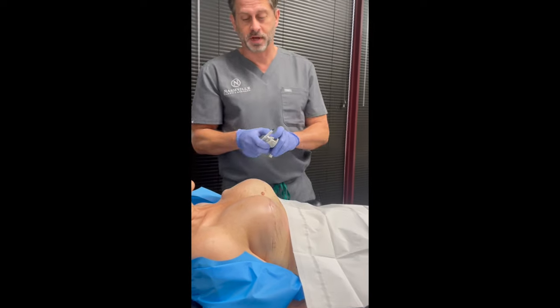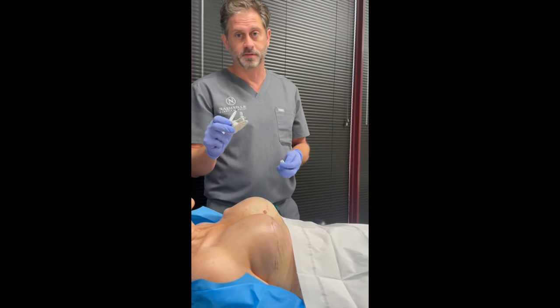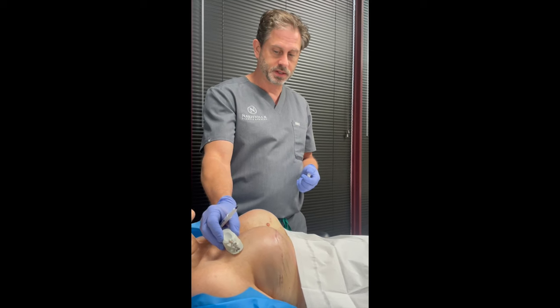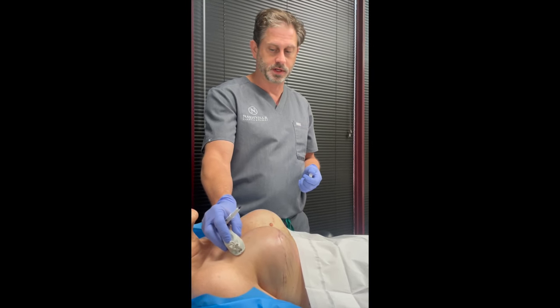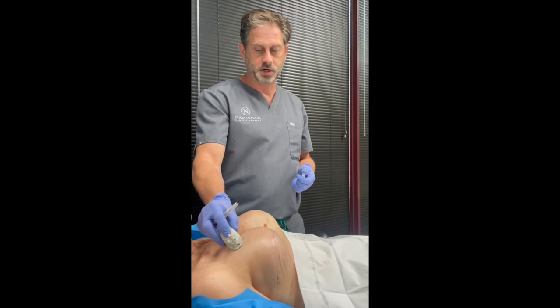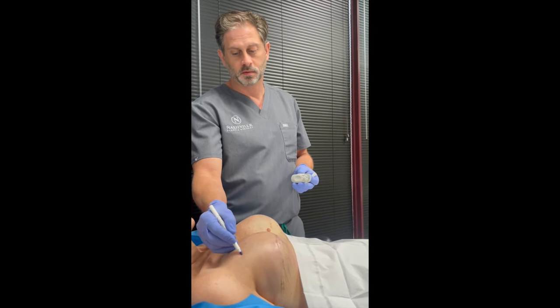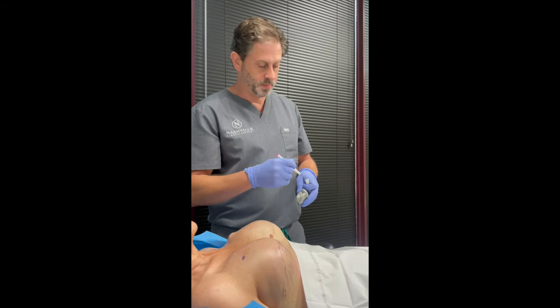Today we're going to start with the expansion process. The way we locate the fill port is through this little stud finder, which locates exactly where on the expander the injection port is. We locate it, mark it with a little marking pen, and then prep it.